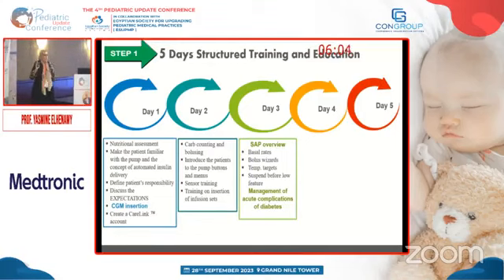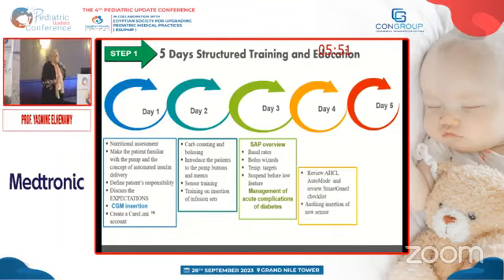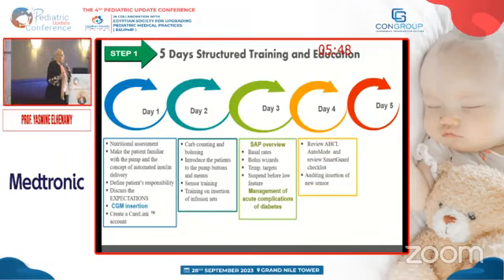وحاجة مهمة قوي قوي we need to emphasize على the education of acute complications of diabetes. مهمة قوي hyperglycemia, sick day management. تعمل ايه لو لقيت عندك hyperglycemia when to suspect انك محتاج تغير الانفيوجن سيت. بعد كده بيجي داي 4. داي 4 بنراجع بنعمل education على الاوتو مود ونريفيو السمارت جارد تشيك ليست.